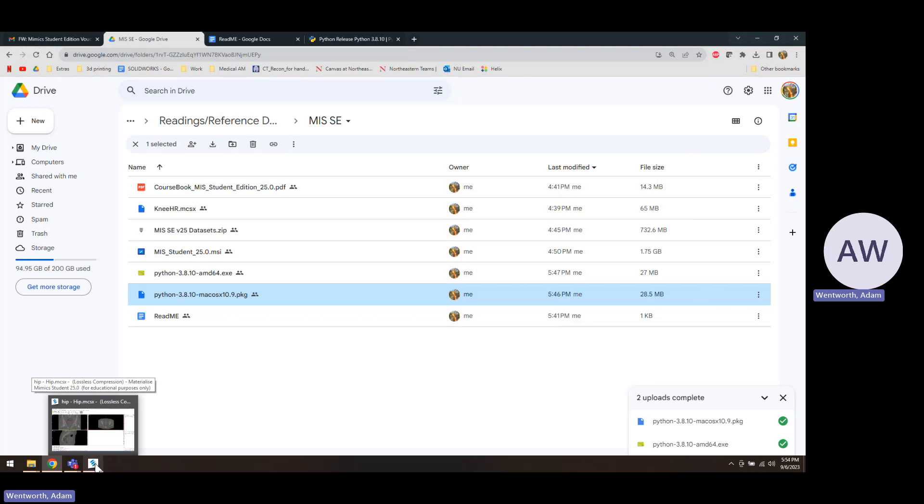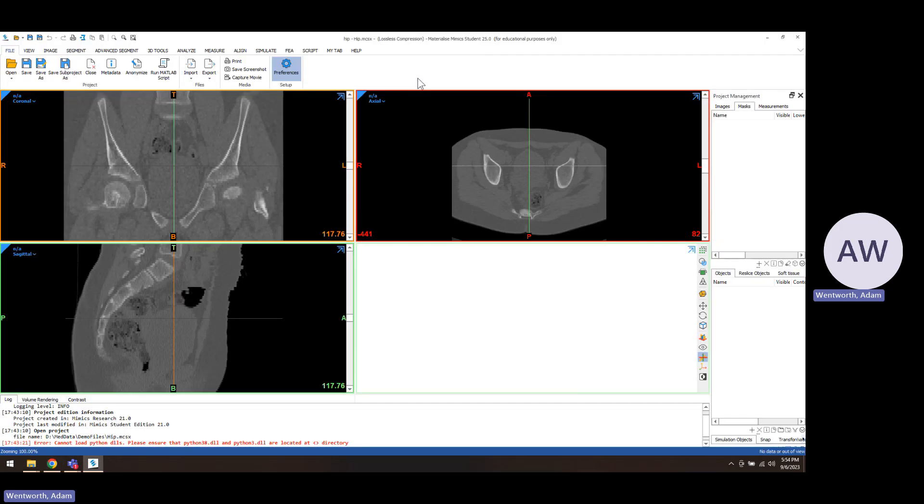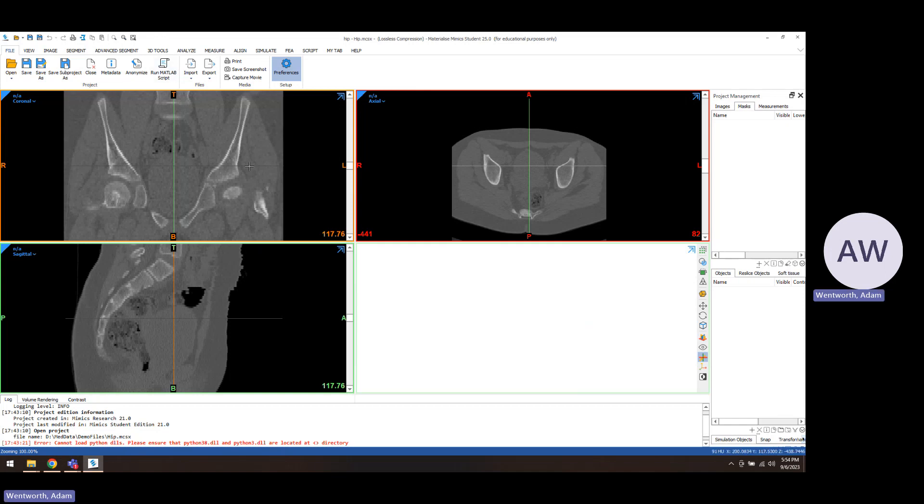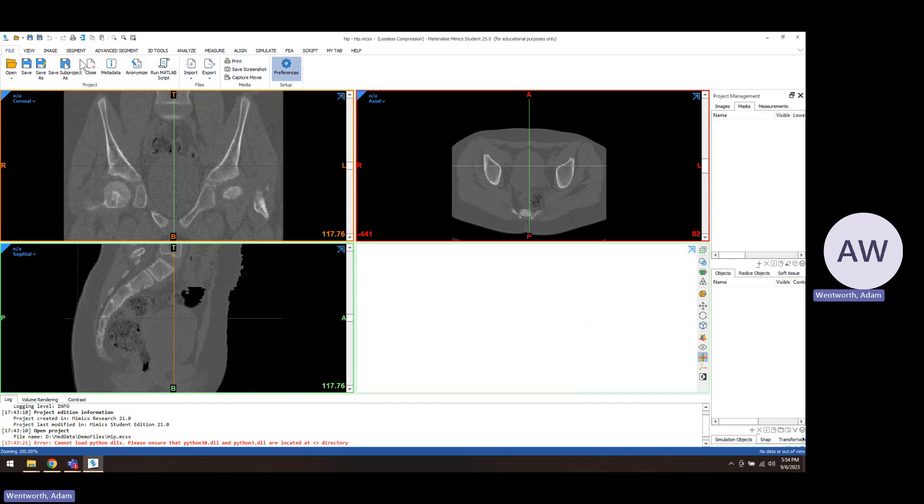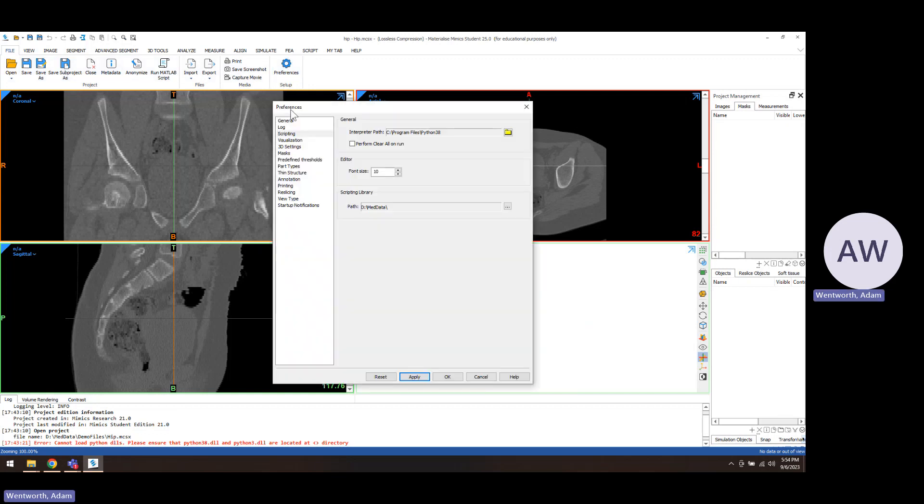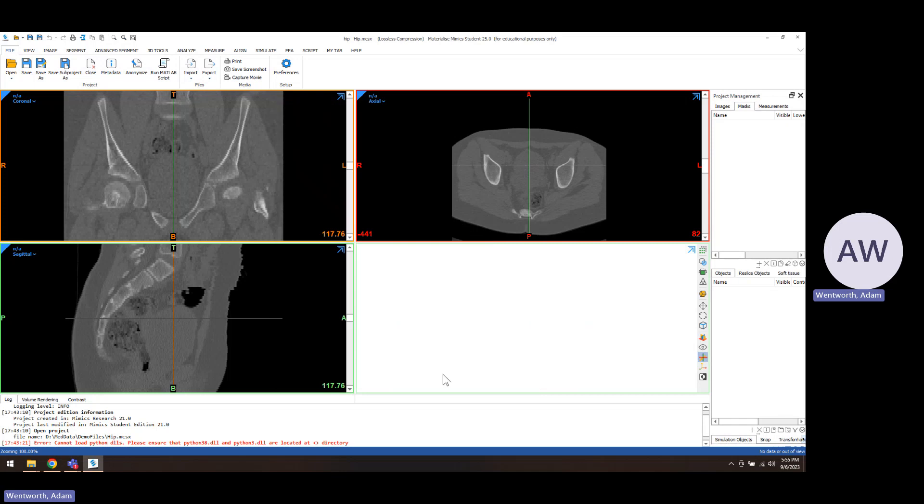Then what you're going to do is open Mimics. If you haven't installed this yet, you'll have a voucher code so you put that in. When you set up scripting for the first time, you're going to need to go to File and Preferences. Under the Scripting button, which is the third one down, you're gonna have to choose the main Python folder as your interpreter path and then click OK.